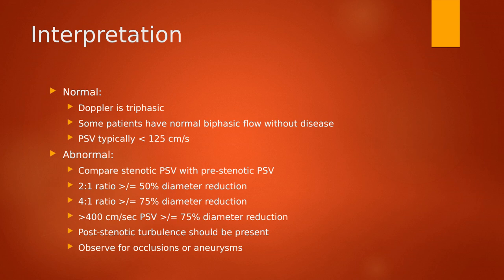If you see a biphasic waveform, no spectral broadening, no mosaic pattern of the color, everything looks good with color evaluation, you go to Doppler it, it's 120 centimeters per second, still beautiful, perfect, normal. We're not going to bother with it.